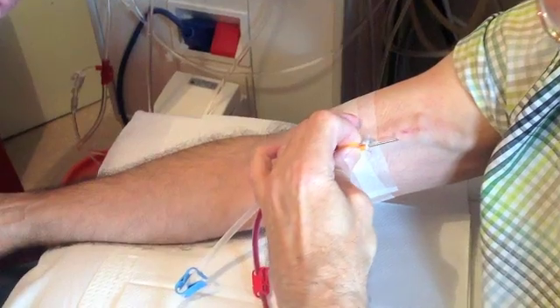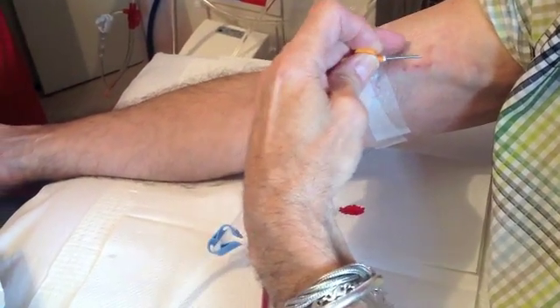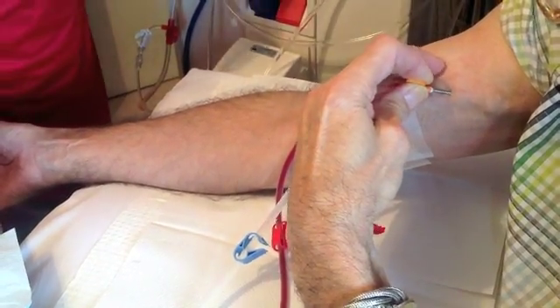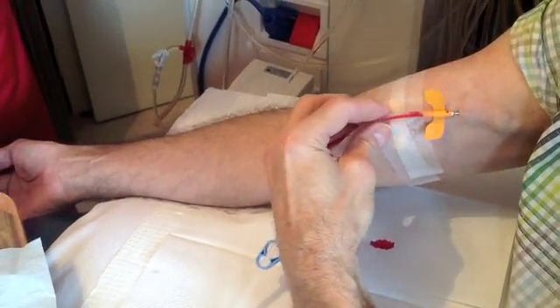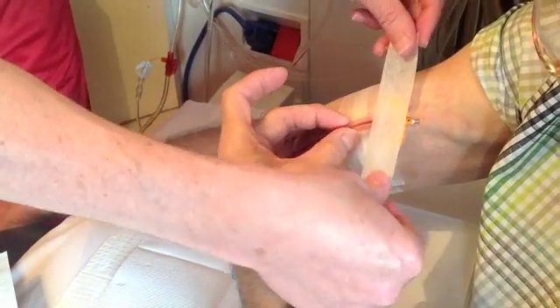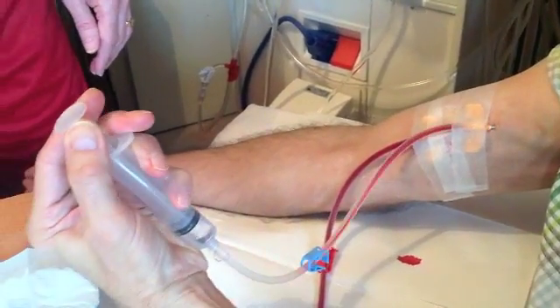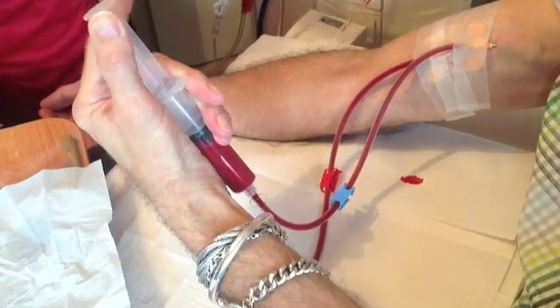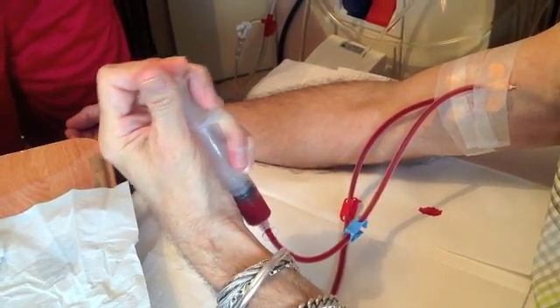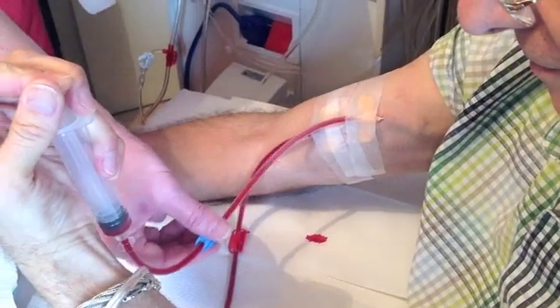I do this so I know where the needle's going to be going. Place again against the skin and gently push. No blood — that's an easy one to do, a very good one. We do normally get a little bit of blood. Tape down to hold the needle in position. Check the syringe flow — do this every time. And again, clamp that one off.